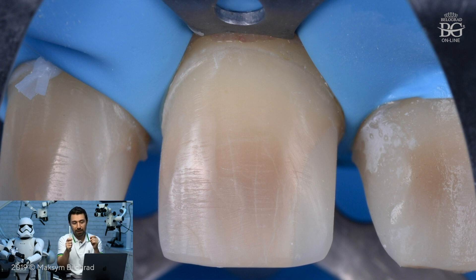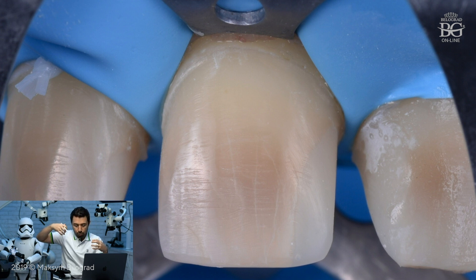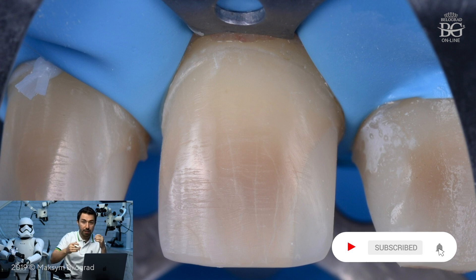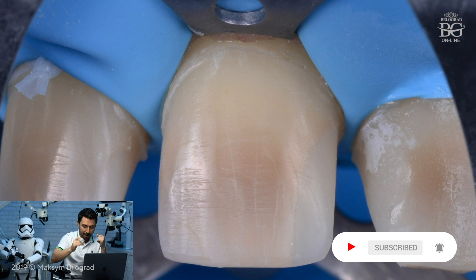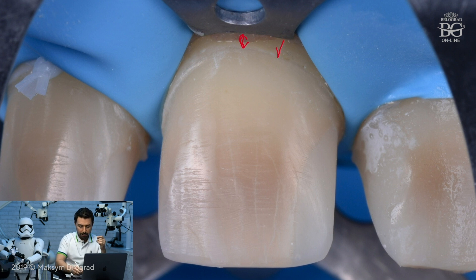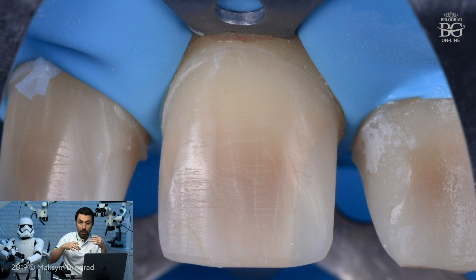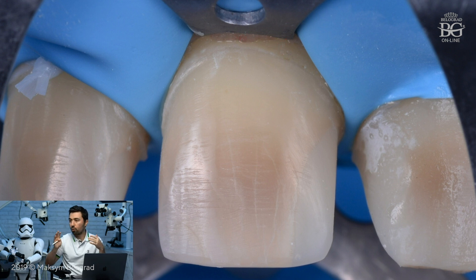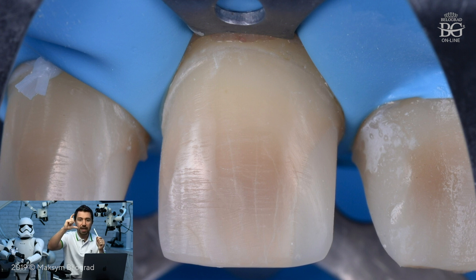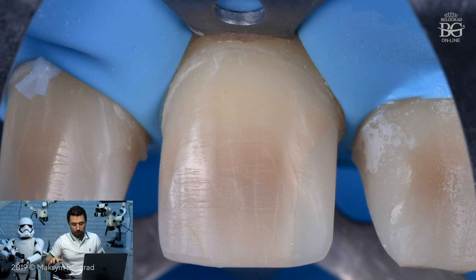I moved the finish line slightly down compared to the previous level, making it intracrevicular with low speed, high magnification, and precise control — keeping enamel. I can see where enamel ends and cementum begins thanks to the rubber dam retraction. An important tip: if you use a clamp, it may retract soft tissues very aggressively. When prepping with rubber dam and a clamp, your finish line should be one to one-and-a-half millimeters shorter from the clamp level. That ensures you are at the beginning of the sulcus, not going full depth — ideally 0.3 to 0.5 mm into the sulcus.